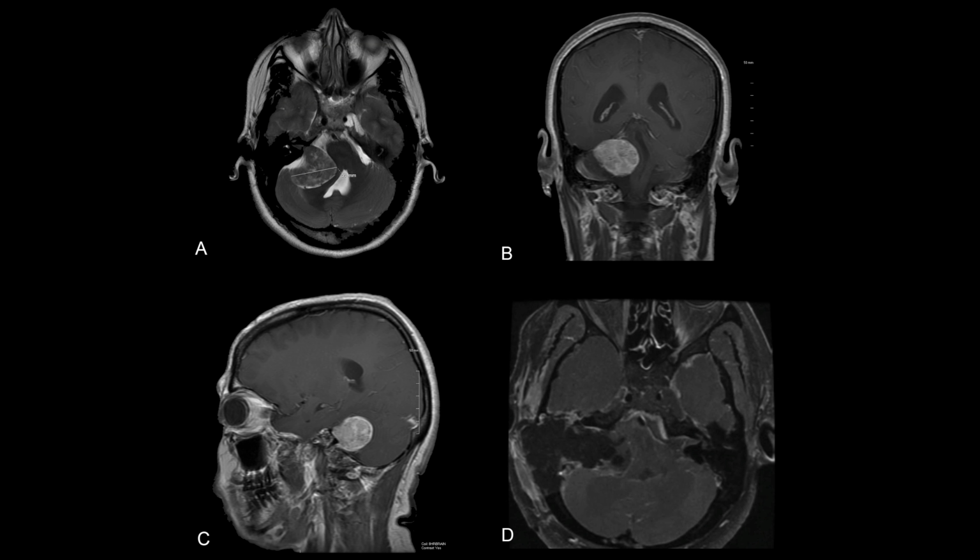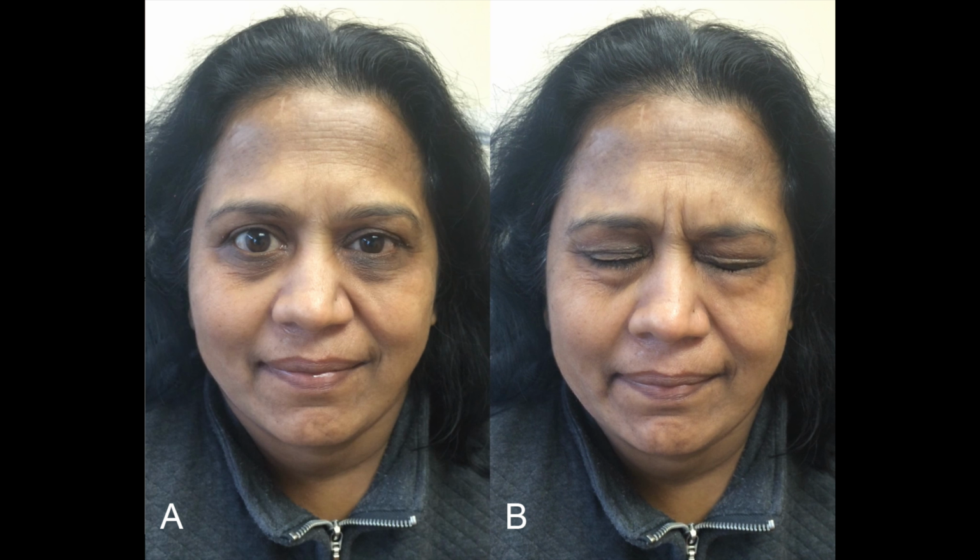The preoperative MRI shows a massive cerebellopontine angle tumor with marked brainstem compression and shift. This patient presented with acute brainstem symptoms, and the procedure was staged 1 week apart after stabilization. Even the first stage, simply removing the bone, provided partial posterior fossa decompression, allowing the brainstem to relax before tumor removal. At the 3-month follow-up, the patient shows excellent facial nerve symmetry and full eye closure, with only a very slight increase in eyelid opening, a House-Brackmann grade 2 outcome.